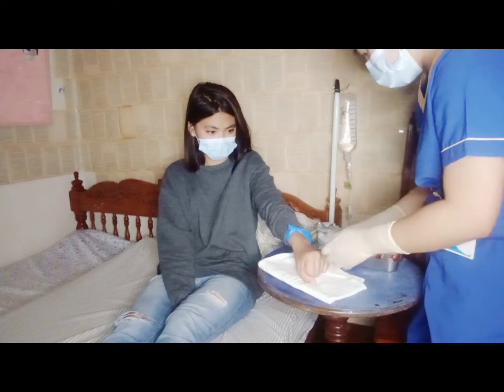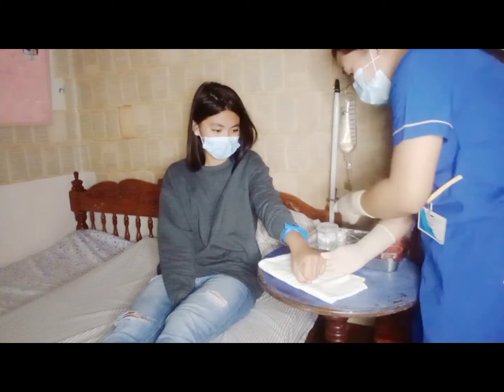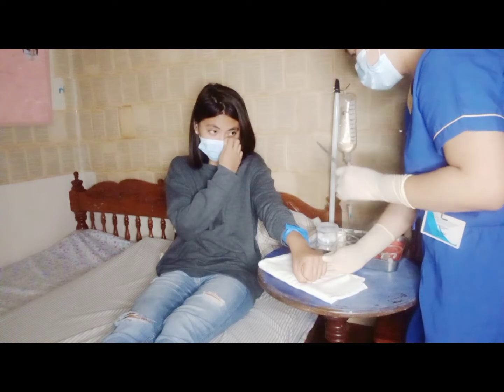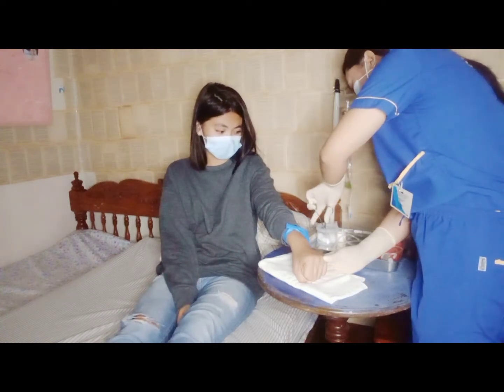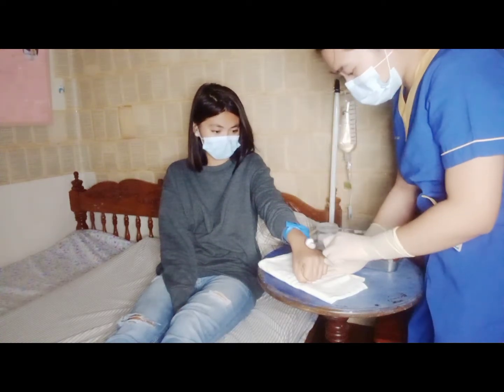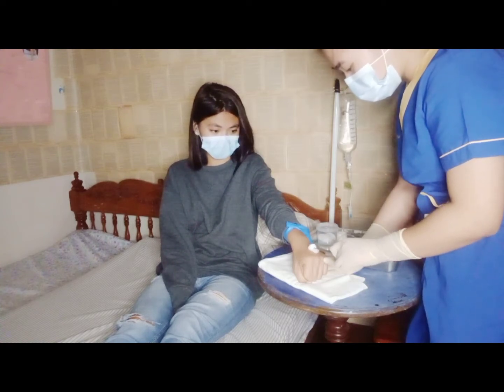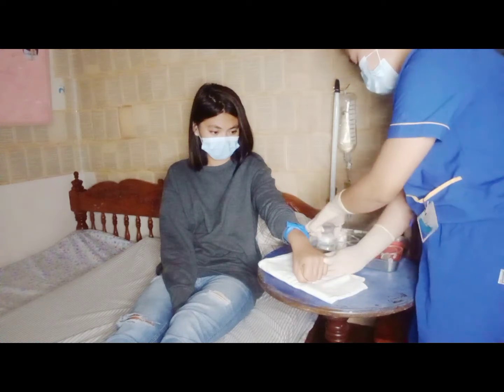Ganyan. Okay. So, lilinisan po muna natin, ma'am, kasi yung mga bacteria or microorganisms na nandyan ay pwedeng maisama sa needle at pwedeng sumama sa daloy ng dugo ninyo. At pag ganun yung nangyari, magkakaroon ng problema. Okay, so you'll clean the entry site at least 30 seconds. So we start at the center, which is the entry site, and around the entry site. Then discard.